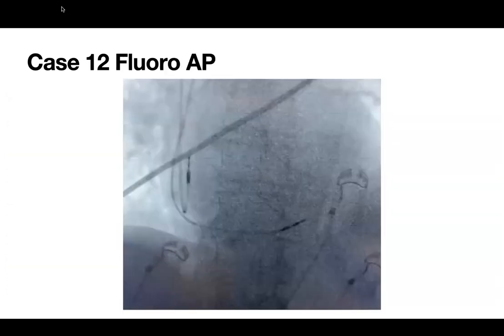Yeah, so in this patient, when I set up to do the cases now, I'm putting the V1 low. I just wanted to show, this one was with a Biotronik lead. We have a back order on the 3830 lead, so I put it in with the Biotronik lead. You see V2 is here, V1 is over here, but if V1 was in the standard position, it would be up here. And I'm thinking, if I really want to know if I'm going away from the septum, in some cases, depending on the anatomy of the patient, maybe the location of V1 is the place to be here. I don't know. It depends on the patient's anatomy. The septal relationship to V1 has a lot to do with whether or not an R prime is going to be present there. Go next.